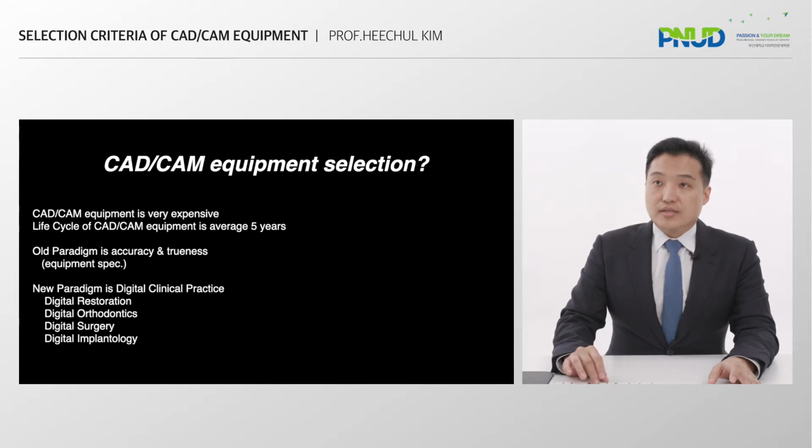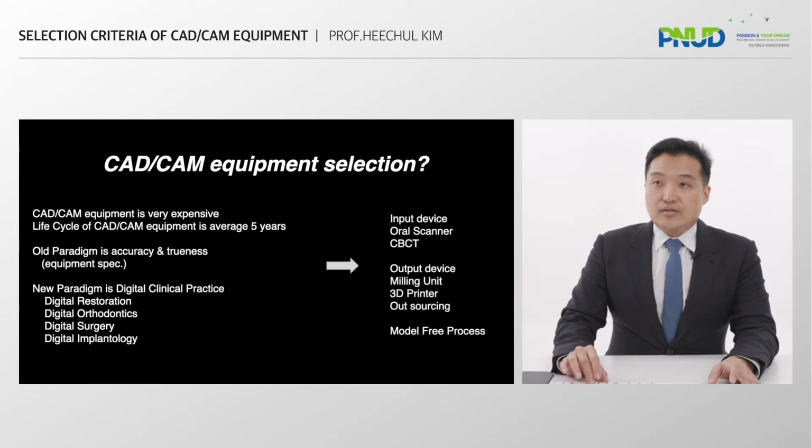Most of the CAD/CAM dental equipment focuses on the restoration aspect. On the other hand, in the field of orthodontics, an intraoral scanner that can accomplish full mouth scans is mandatory, rather than one that has more accuracy on a fragment. Also, you must analyze whether you'll be focusing more on one-day visit restorations or zirconia restorations, especially for implant patients, before deciding on a milling unit.